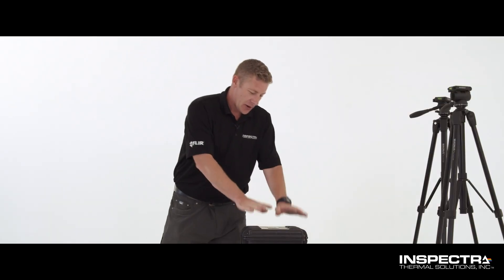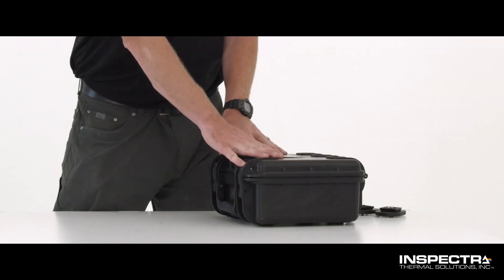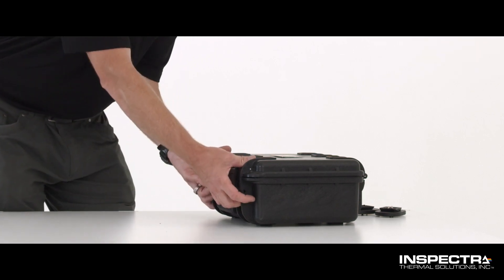Hello everyone, I'm Chris with Inspectra Thermal Solutions here today to show you our newest camera system. This is for detecting elevated body temperatures. I'd like to show you inside here what we have. This is the Medicas system that we're offering.